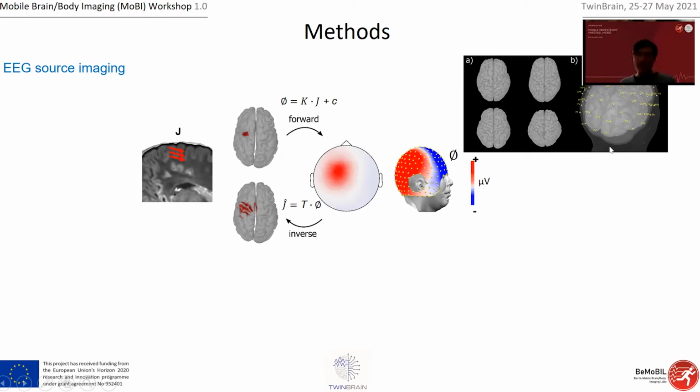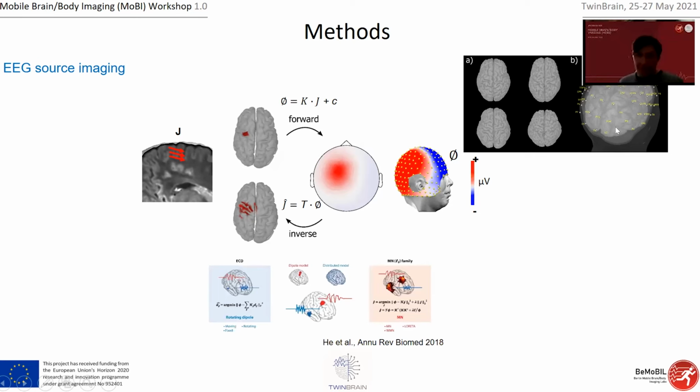But you cannot invert that very simply if you don't make additional assumptions. One very prominent assumption, and I think it is very prominent in the EEGLAB world, is that if you have one dipolar source or one dipolar topography, you can go for dipole localization, because you know there might be one very strong dipole producing a certain configuration that is your IC topography.